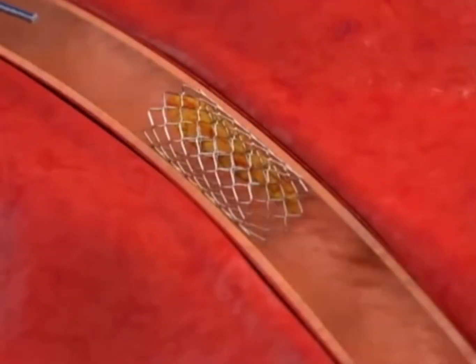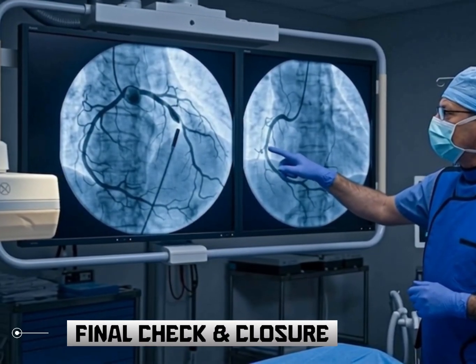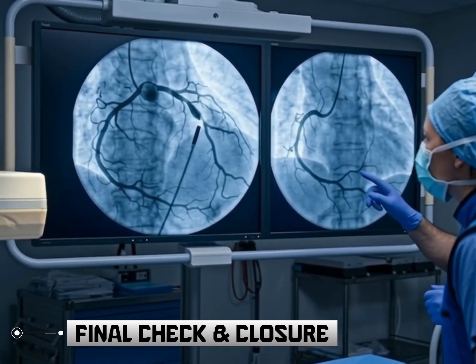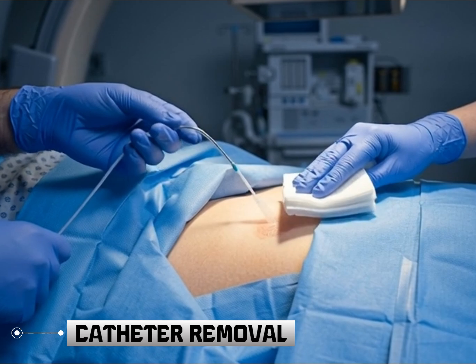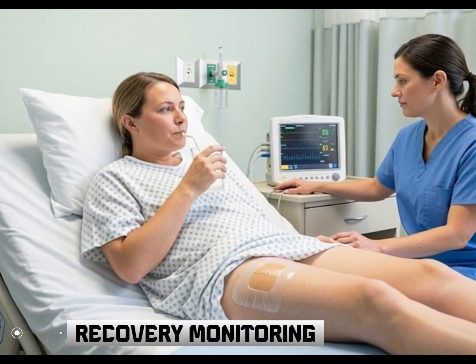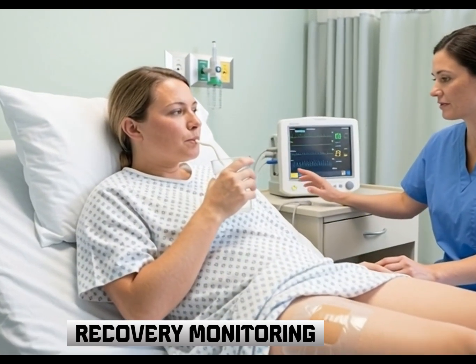Isn't it amazing? And just like that, the heart's traffic jam gets cleared. Now we check to confirm that the procedure has finally succeeded. Next slide, it is removing the catheter. With the procedure complete and verified, the catheter must be withdrawn. To conclude, the patient must be in recovery, drinking plenty of water, and is encouraged to help flush out the contrast dye from the body.